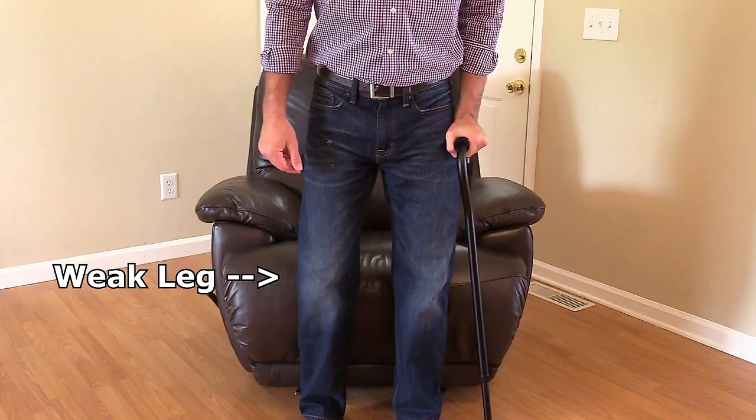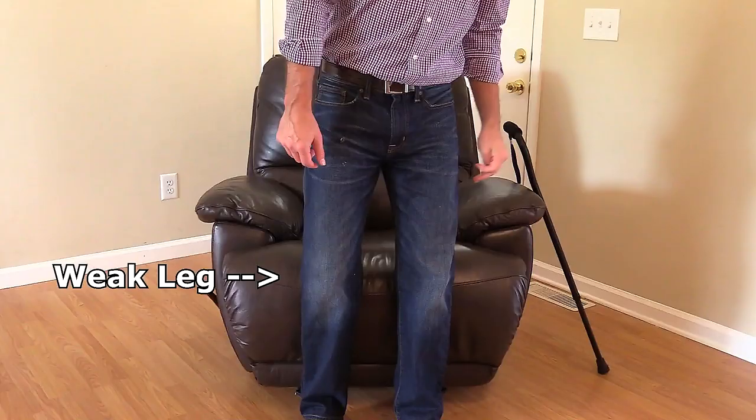The patient will place weight on the hands while keeping the weak leg extended out and bend the strong leg to sit down.